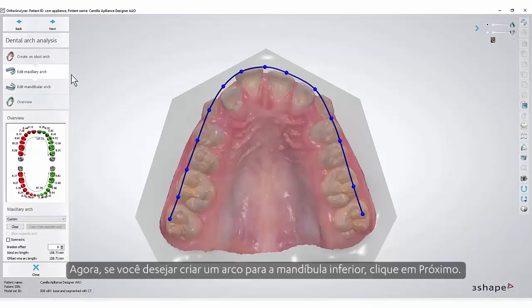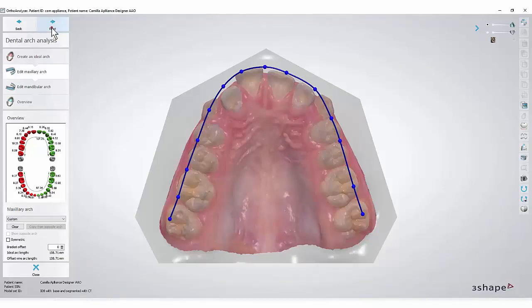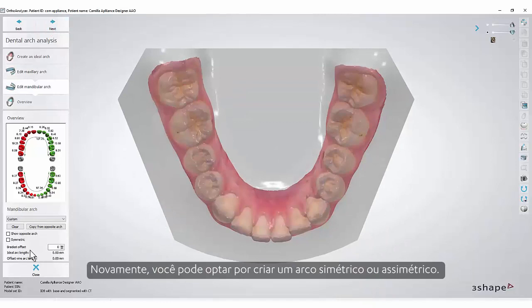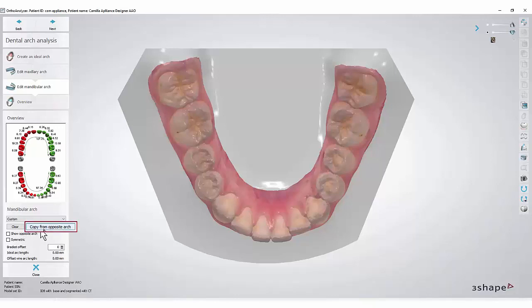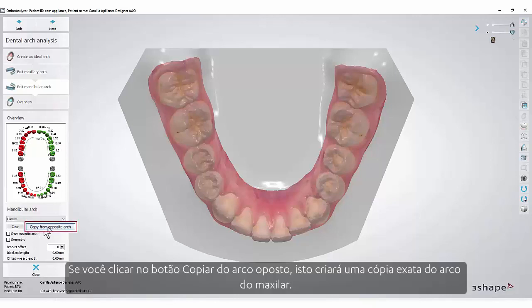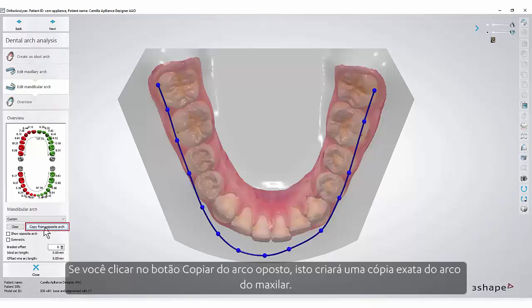Now if you wish to create an arch for the lower jaw click Next. Again you can choose to create symmetric or not symmetric arches. What is very important is that you have the possibility to copy the arch from the opposite side. If you click the Copy from Opposite Arch button, this will create an exact copy of the arch from the maxillary.